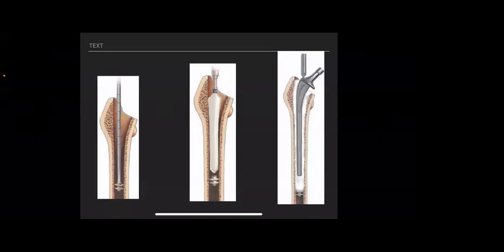So don't rush. As I told you, this is the time when you should not talk. Everybody should be silent and focused on the procedure, and they should be helping each other, and everybody should know what his job is while this step is being done.